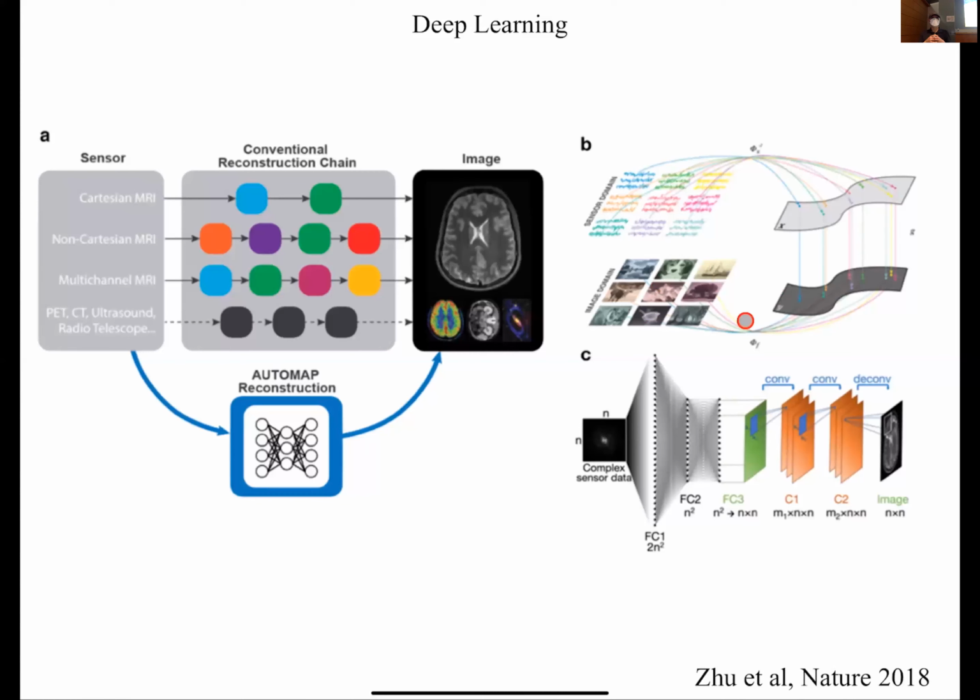And the remarkable thing is you don't have to even train this on MRI data, you can just train it on any biological looking images, because biology tends to use the same patterns over and over again. So you can train on trees, plants, animals, stuff like that. And it does remarkably well.